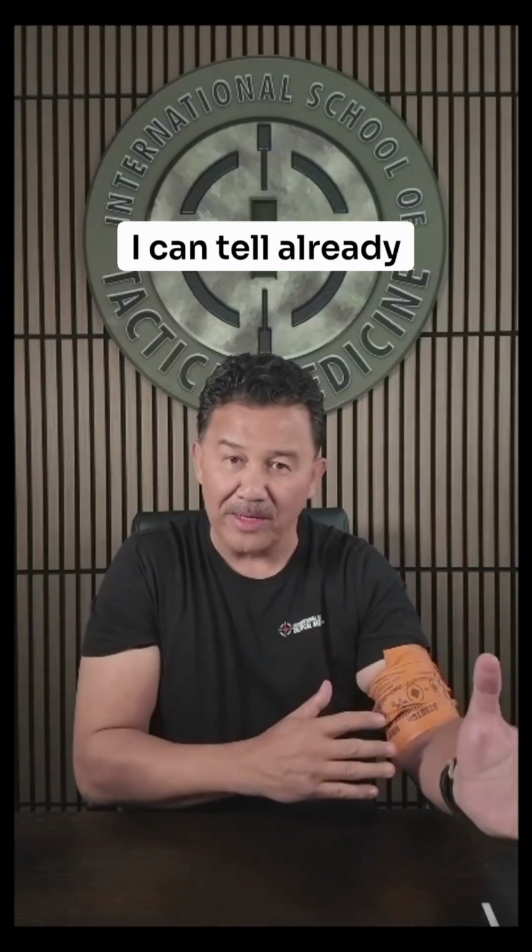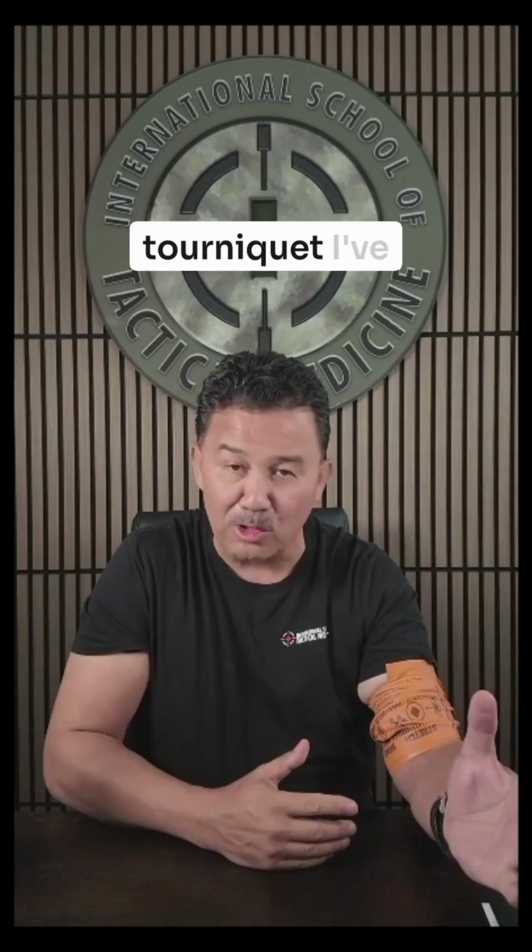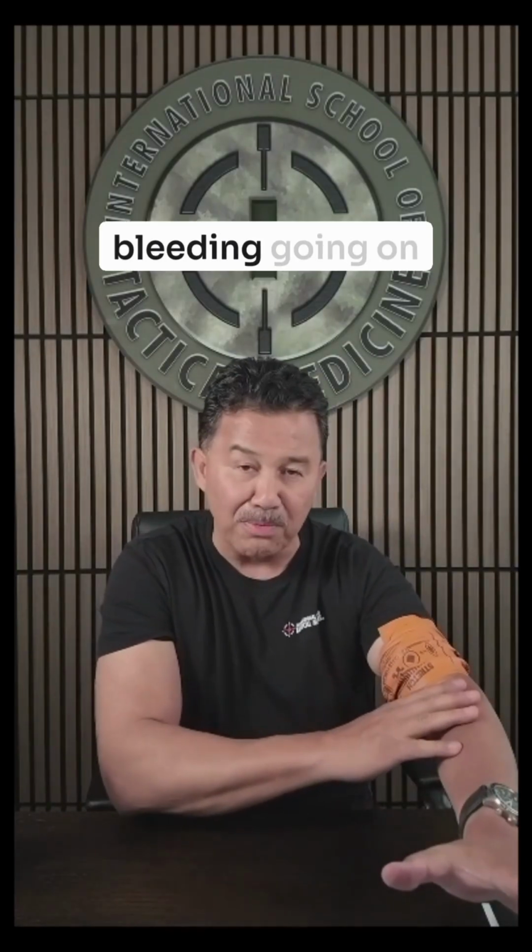I can tell already that it's as tight as any other tourniquet I've ever applied to myself. I would know because there is no further bleeding going on, and then I could confirm it by checking for the absence of a pulse.